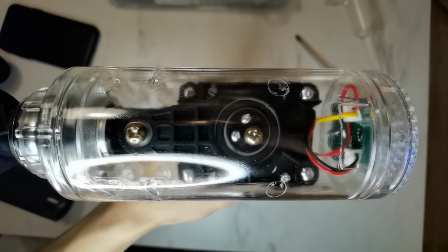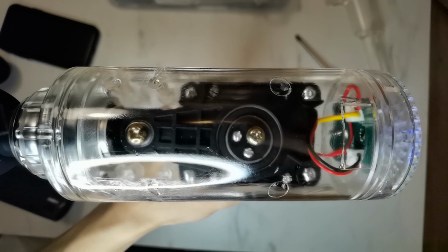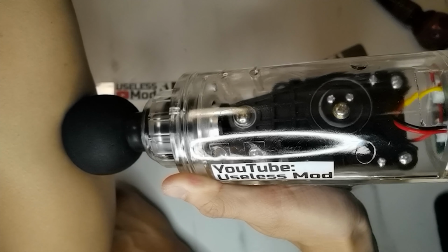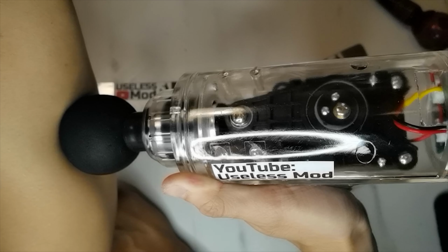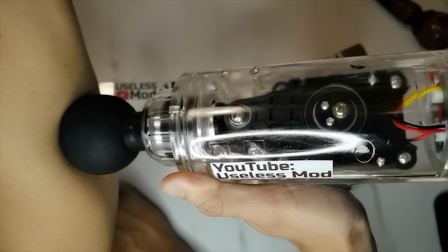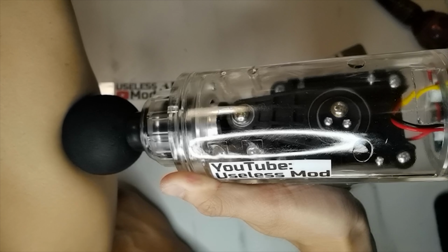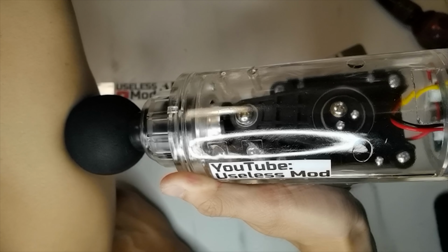This is 32 times slower than real speed. And this one is 64 times slower than real speed. You can clearly see the crankshaft moving. This is a very good example of how to transform rotational motion into linear motion. And you can see the muscle move like a liquid. It's very pleasing to watch.